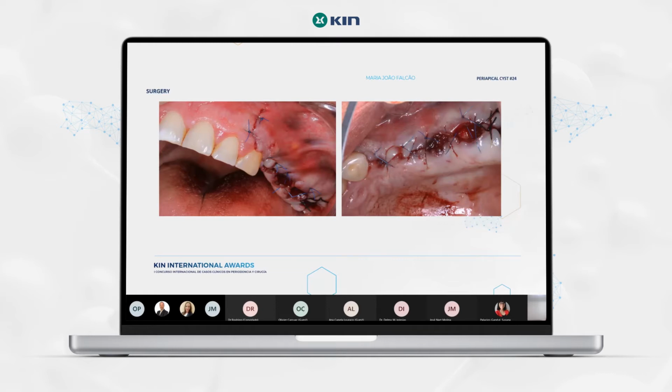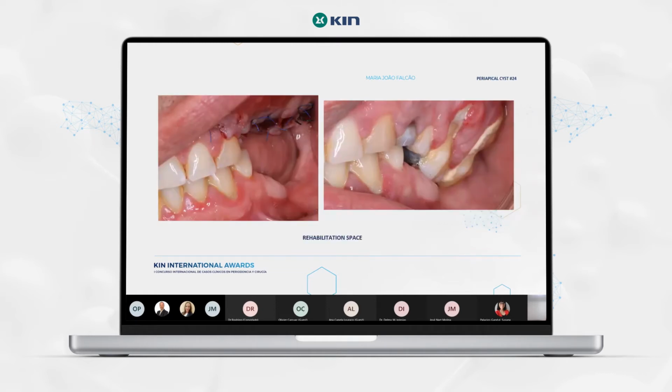Here you can see in the pictures the difference from the first image we saw at the beginning of the presentation, where we see the dropping tooth and no space for any kind of rehabilitation, and the aspect of the gum. And then here on your left side, you have the space that we have now after all the extractions. We have very good space for posterior rehabilitation of the lower and the upper jaw.